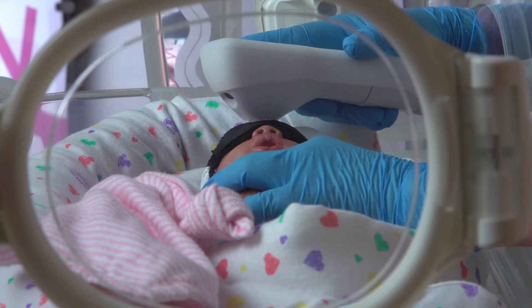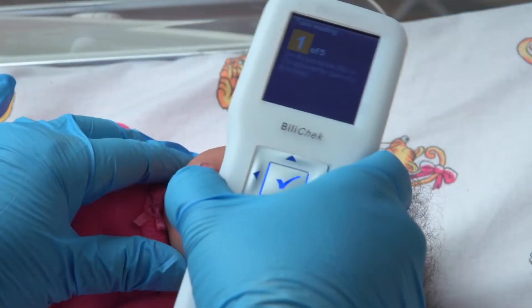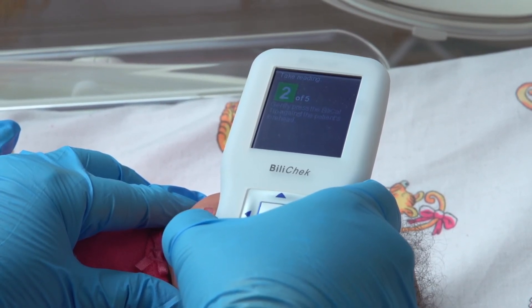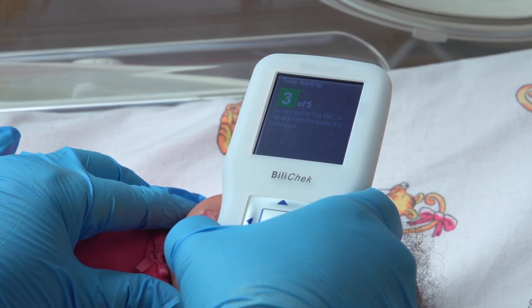The information provided by the Bilicek is evaluated by the neonate's physician for appropriate patient management. In this video, we provide an overview of bilirubin assessment and demonstrate operation of the Philips Bilicek Non-Invasive Bilirubin Analyzer.